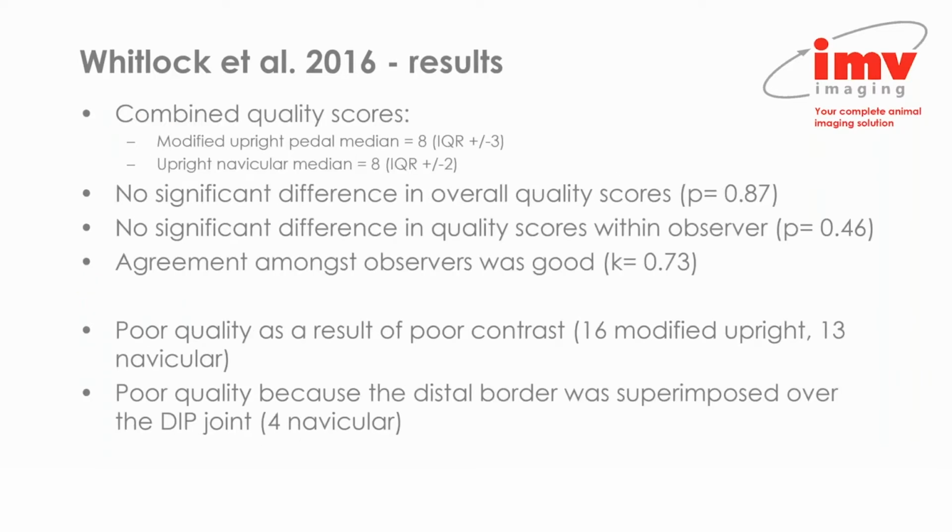So for the results, when the quality scores for all of these observers were combined, there was actually no difference in overall quality scores. There was also no significant difference in quality scores within each observer between the one modified upright pedal view and the navicular view, and the agreement amongst the observers was good.